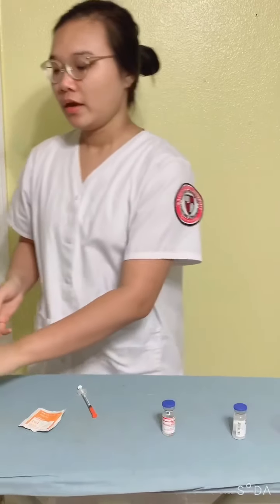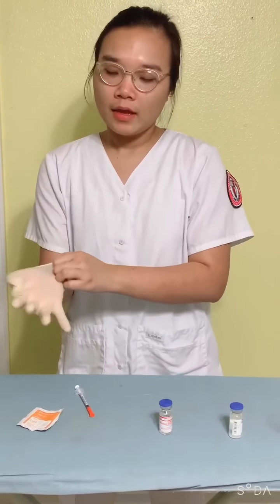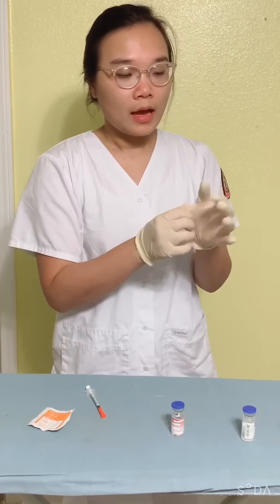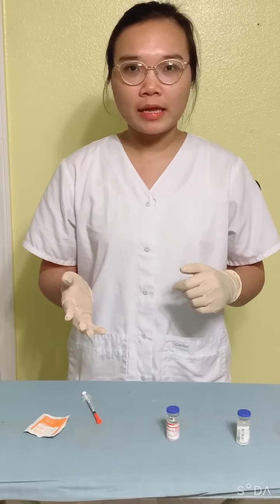Now I am going to perform mixing and administration of insulin. First, I would compare the physician orders with the MAR, and then I would identify the patient, perform hand hygiene, put on clean gloves, and then I would perform a focus assessment such as CBG level, signs and symptoms of hyperglycemia or hypoglycemia. Then I would compare the medication with the MAR and check for expiration date.